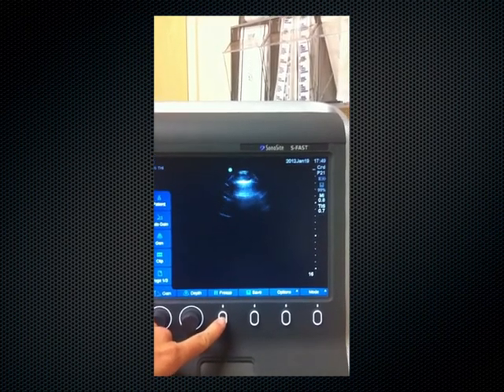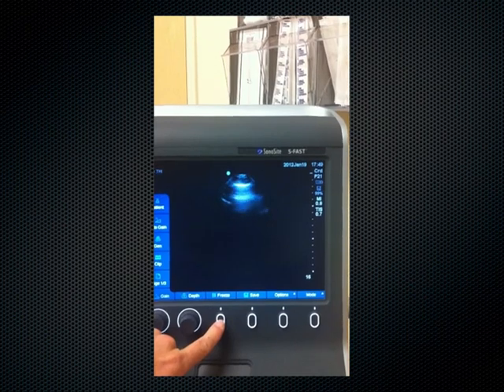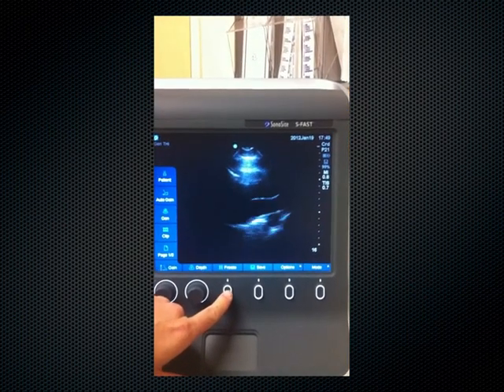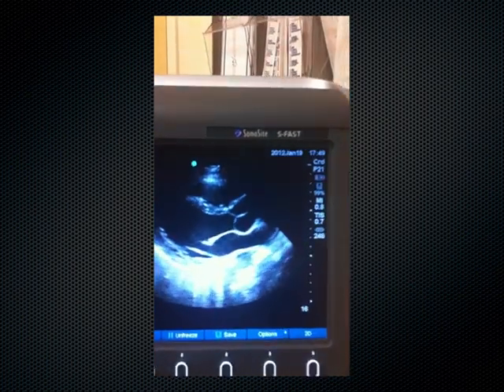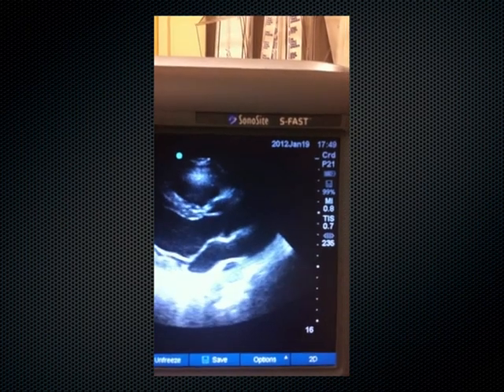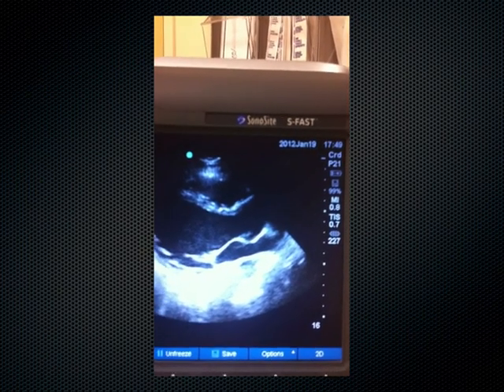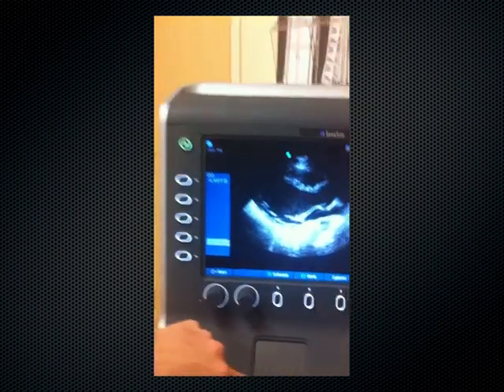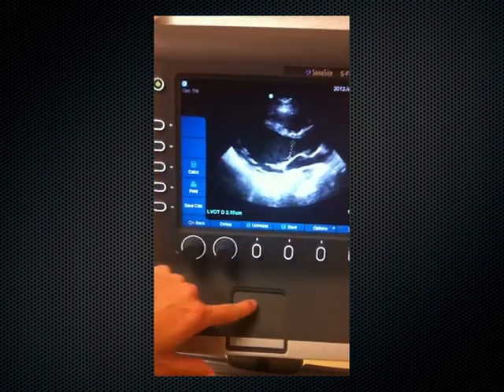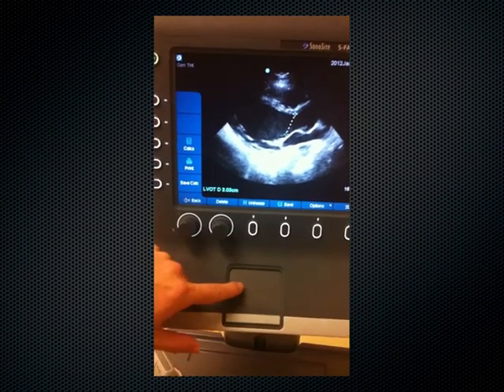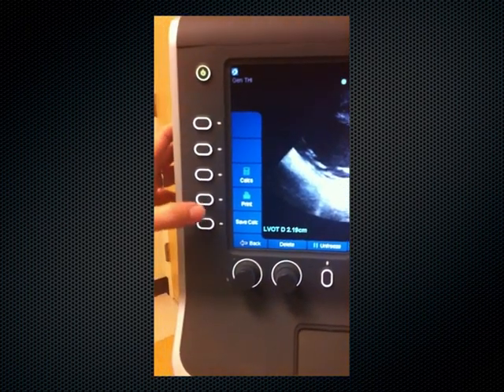I'll have the patient let out their breath. I'll scroll back to when the actual leaflets are open — this looks like the maximal excursion right here. I'll hit calculations, then LVOT under cardiac output, which gives me calipers. I'll place the calipers and that gives me a diameter of 2.19 centimeters. I'm going to save this calculation.